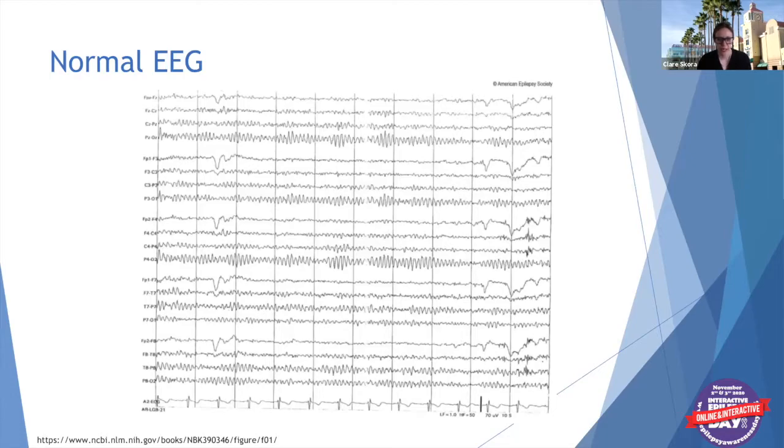So this is just a screenshot of a normal EEG. And if you remember some of the schematic that I showed you at the beginning, just looking up here, you can start here. This is the left side because of the odd numbers. Right side, left side, right side, and then the F is frontal, kind of central, and then this is the posterior region. And so this is a normal EEG, and in a normal EEG, we expect it to look a little bit bland. Overall, the voltages are sort of low. We see this posterior activity that is a waking rhythm that we expect to see.